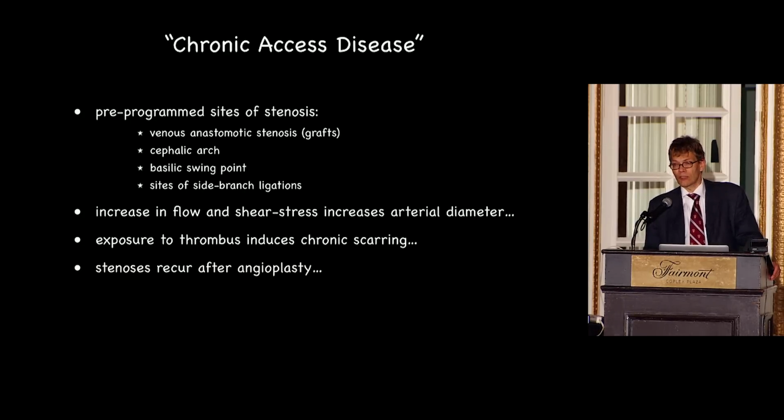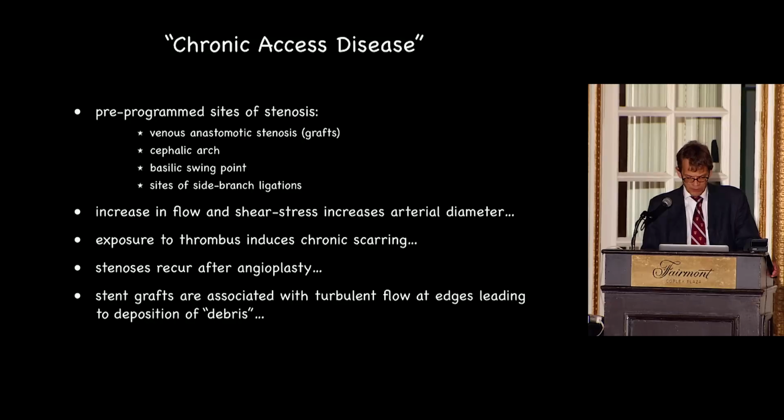There are clear studies that show that if you expose particularly central veins to balloon angioplasty without a good reason, you get faster progression and recurrence of the stenosis than if you didn't put a balloon in. If we use foreign material like stents or stent grafts, they have a different flexibility than blood vessels, and so often we see edge phenomena where there's turbulent flow and there's debris building up over time.